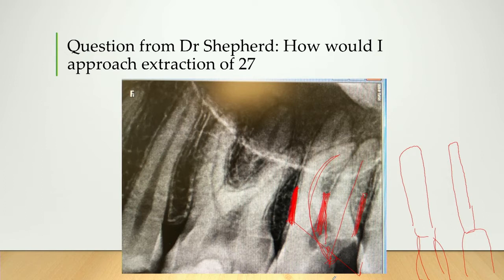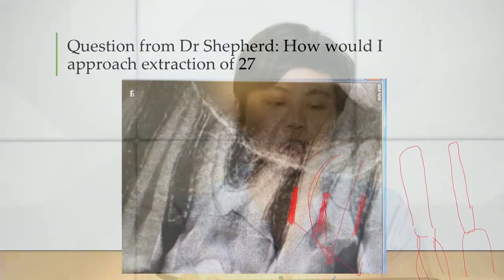Question from Lisa Holiday. Would you always raise a flap when you decoronate a tooth? Very good question, and my answer is no. I generally don't raise a flap when I decoronate a tooth. Why? Because I'm not actually touching the buccal side of the tooth.